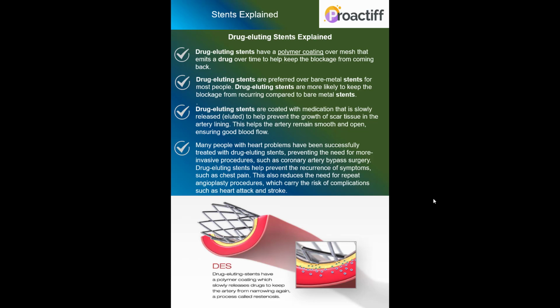Based on the specific scenario, the choice of stents is laid out. This is only to explain to you what the choices available are, and based on the medical conditions, the experts would make the determination of how and what has to be used. And drug-eluting stents are preferred over the bare metal stents for most people, but as I said, it is based on the conditions. The drug-eluting stents are more likely to keep the blockage from reoccurring compared to the bare metal.